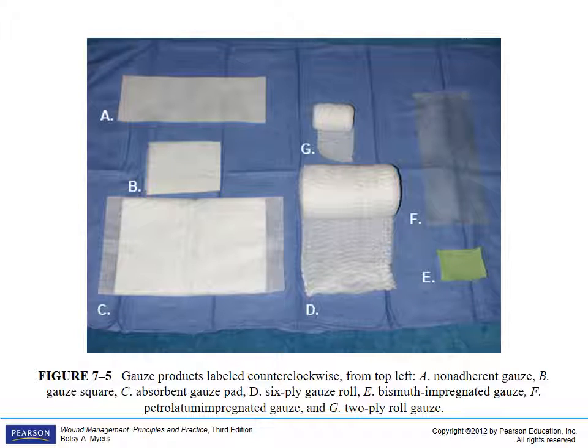Here are some examples of some gauze products. The one on the top is a non-adherent gauze. What makes it non-adherent is that it's impregnated with a petroleum, a Vaseline type substance, petroleum jelly. That's what makes it non-adherent. B is just a plain gauze square. C is an absorbent gauze pad. D is a gauze roll, which is generally used as a secondary dressing on top of another type.